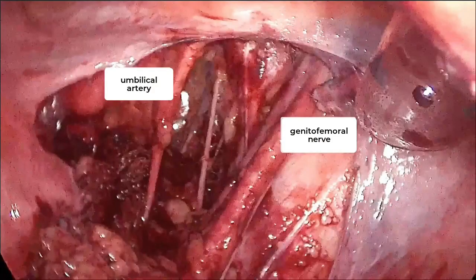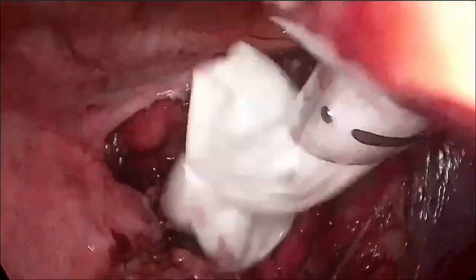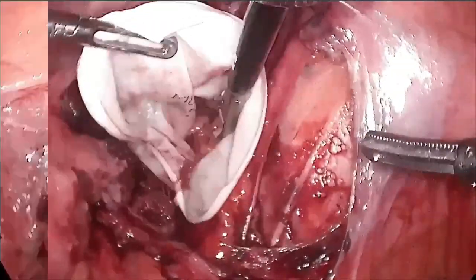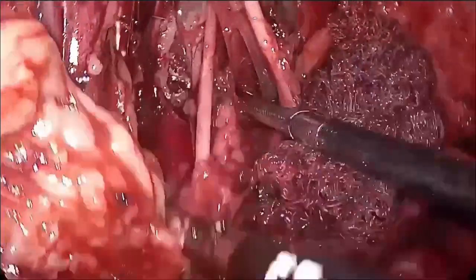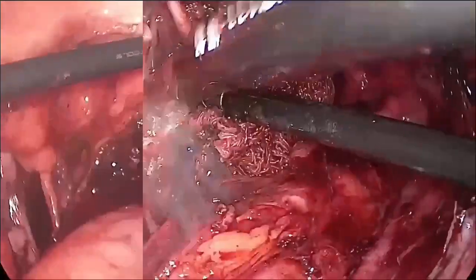After completing the dissection of the right obturator fossa, anatomical boundaries are observed, and the specimen of the lymphadenectomy is placed in a plastic bag. The emptying of the obturator fossa is carried out, with the identification and dissection of the obturator nerve. The uterus is tractioned and extracted transvaginally.